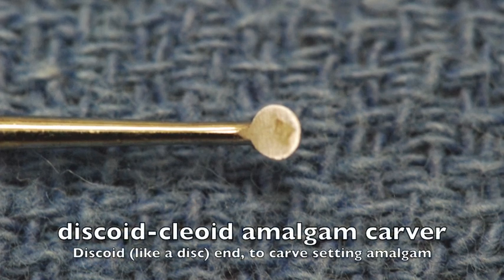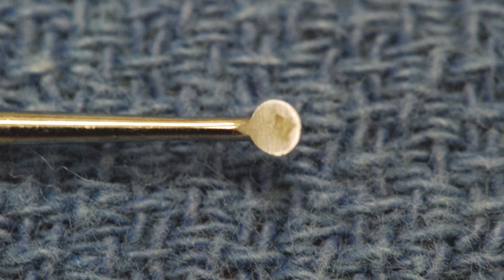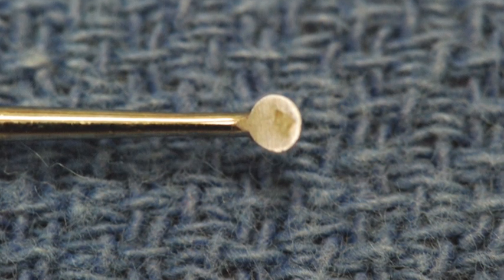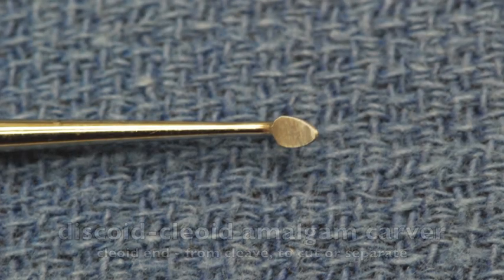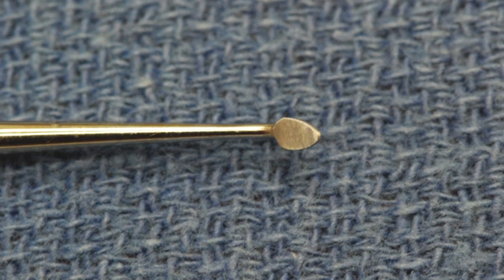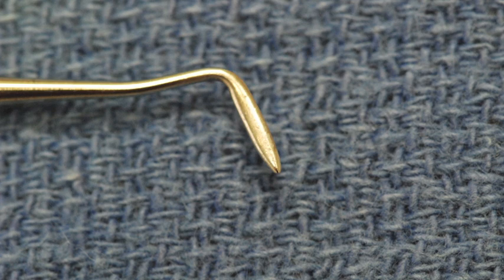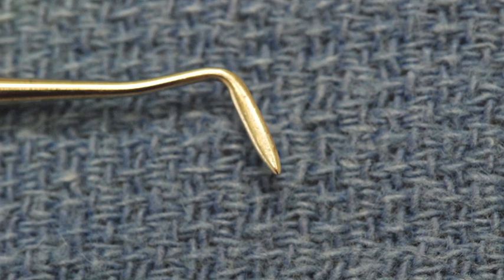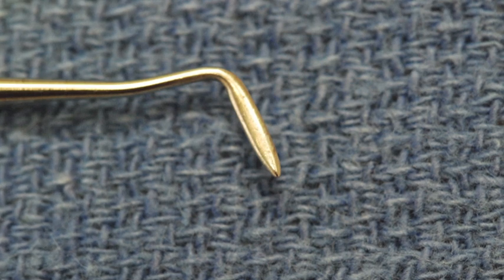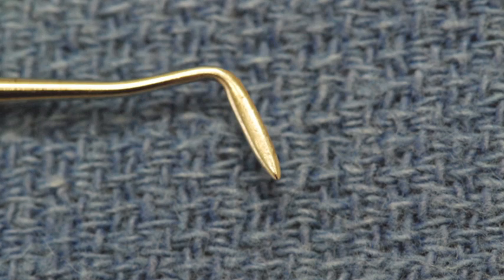These two instruments are actually different ends of the same instrument and they are called a discoid cleoid amalgam carver. The double-ended instrument is for carving and giving anatomical shape to a setting amalgam. One end is round, thus the name discoid, and the other end is pointed, named cleoid. This is a one-half Hollenbeck, a double-ended amalgam carving instrument used to carve and shape to give anatomical structure to amalgam, along with the discoid cleoid.